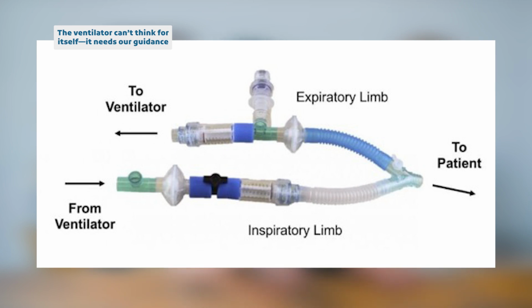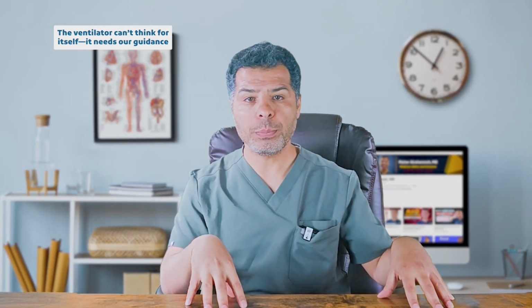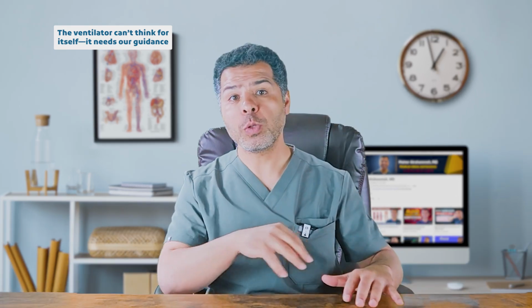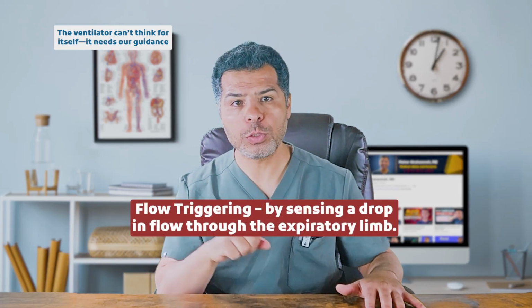But when the patient initiates a breath, they pull some of the air from the inspiratory limb into their lungs, reducing the flow returning through the expiratory limb. The ventilator senses this imbalance and interprets it as an inspiratory effort. It will go ahead and assist the patient with that breath. This is called a flow trigger.